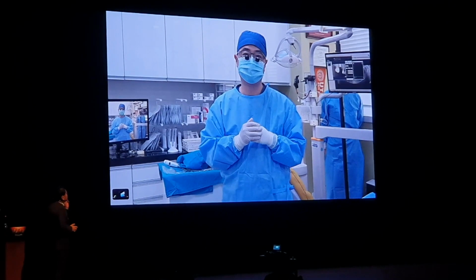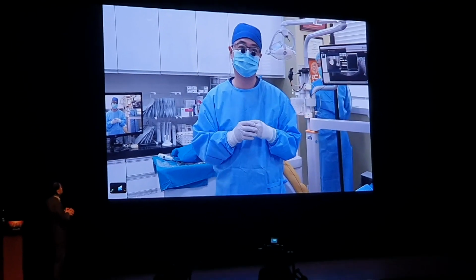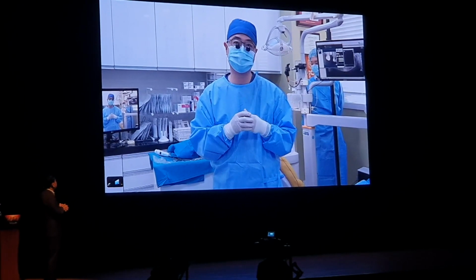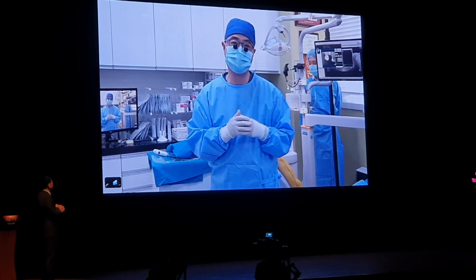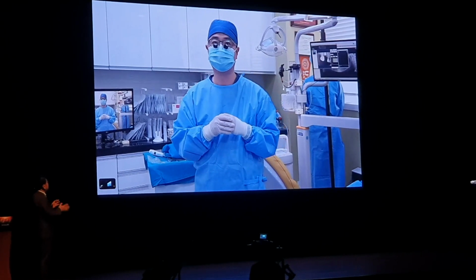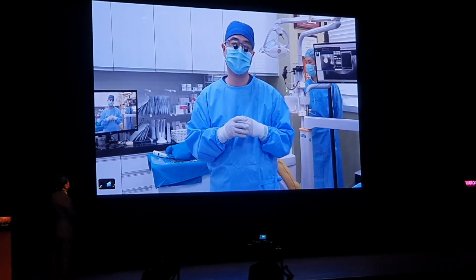Are you planning to scan once the encoded healing abutment is connected? Yes, if time allows, I'll scan the encoded healing abutment and also fabricate milling of a temporary restoration. If we can mill here, I'm thinking of trying to mill a temporary crown. Ah, yes. So immediate loading of the restoration can be possible if there is sufficient initial stability.